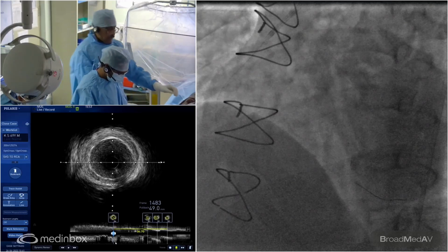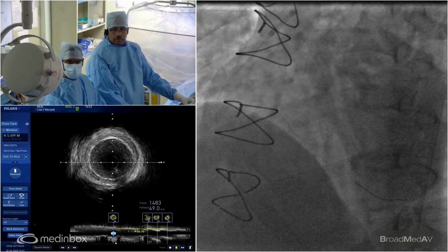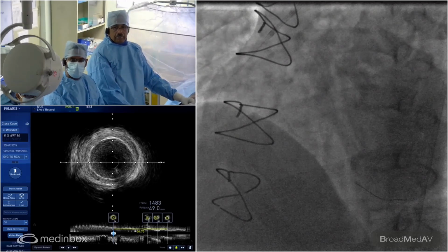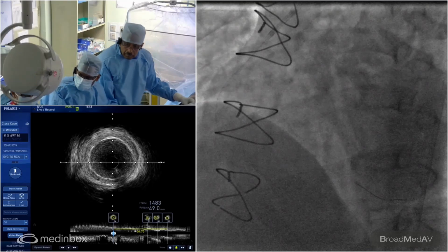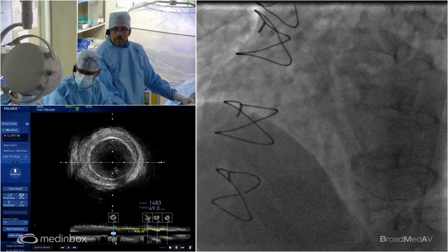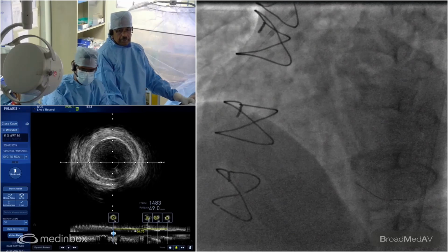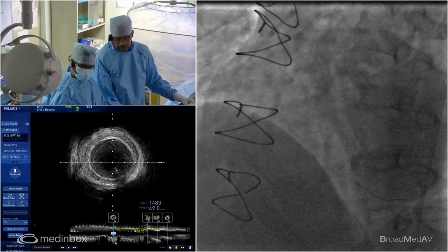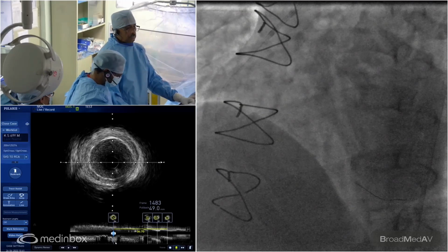Anyway, if we don't have the Resolute, we'll use Integrity. The 2.5 to 3.5 goes up to that size. Onyx will go up to that. Let's check and open. Okay, let's get the Onyx. Get me the 2.5 Onyx to 3.5. Get the 34 Onyx, please. We can always go up a bit. Resolute will not go, sir.